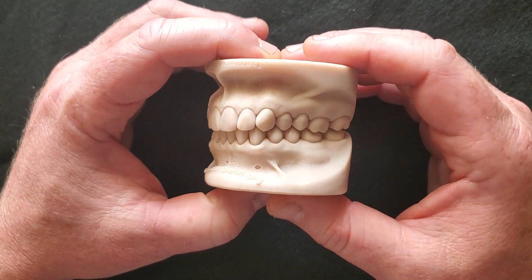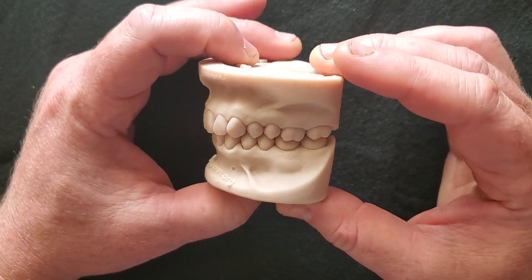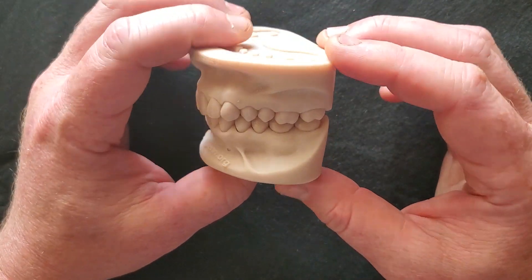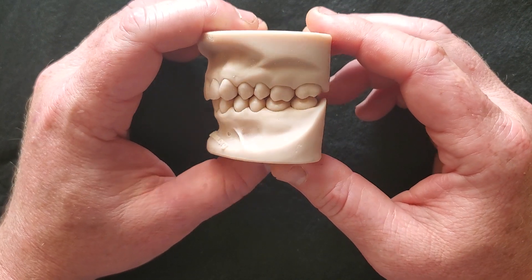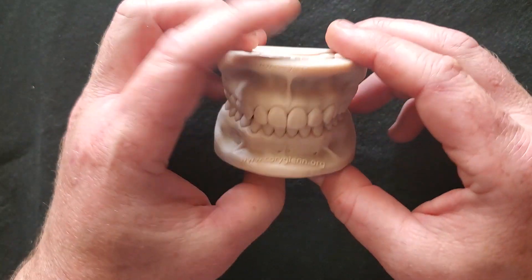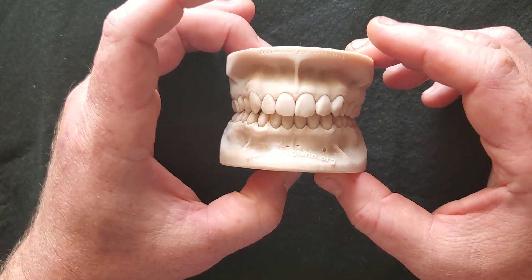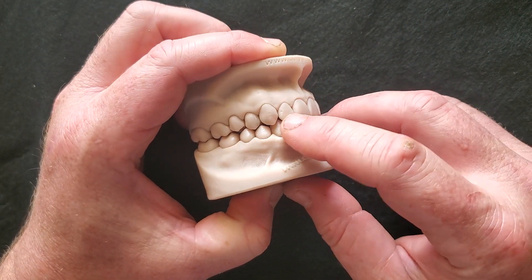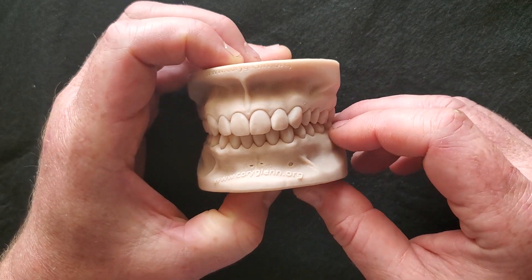When I was in dental school, we had to pay about a thousand dollars for the Typodont, and then it was seven or eight dollars per tooth. So every time you prepped a little class one, you were throwing seven dollars down the drain. This is going to allow you to print the Typodont piece one time and then print the teeth over and over indefinitely.